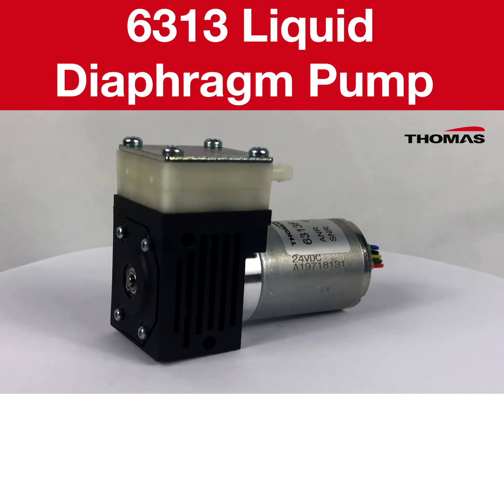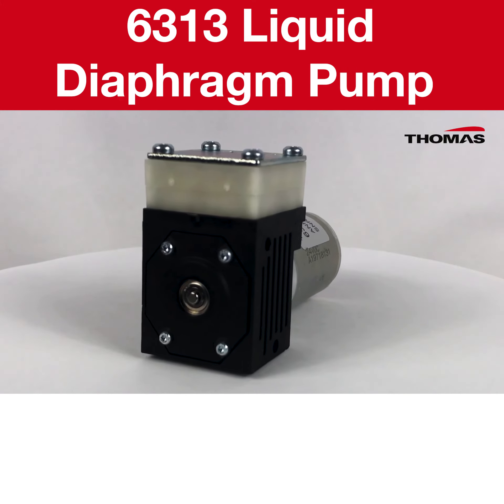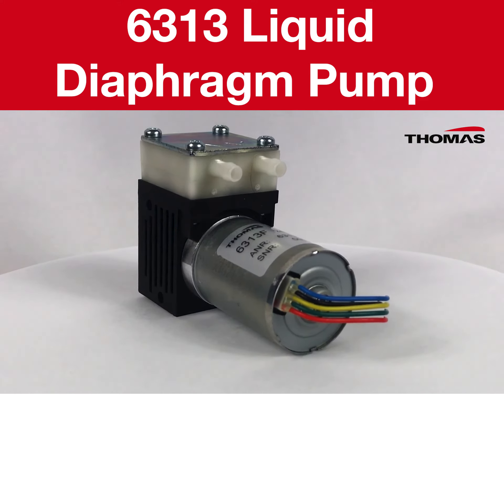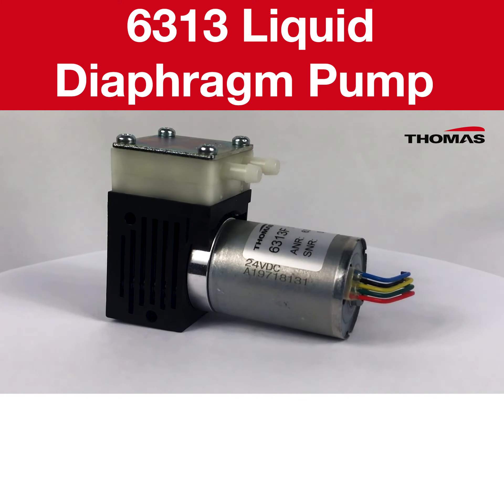In addition we will also provide you with a link where you can easily order your sample of our 6313. You can lean on us to help you make life better. Take advantage of our products to make your products even better. Thank you for joining me today to learn more about our 6313 liquid diaphragm pump.